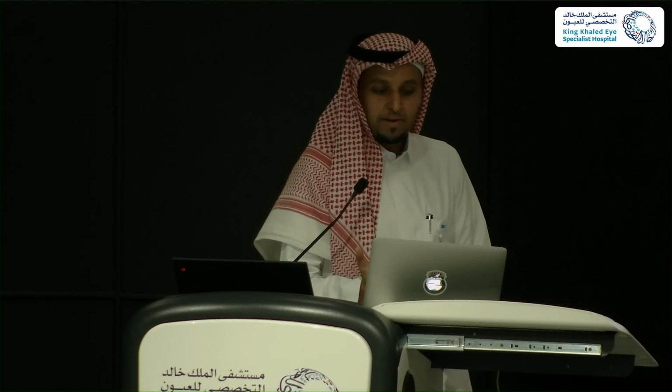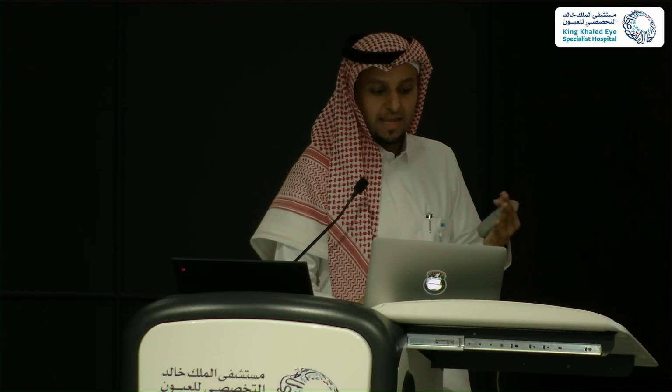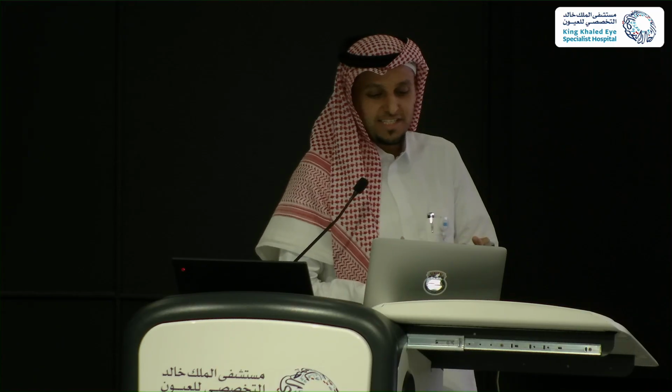So basically, the last procedure in anterior lamellar keratoplasty is DALK, and DALK, based on the Sarnicola classification, is broadly classified into predescemetic DALK and big bubble DALK. However, after Dua's layer was introduced, the classification is now a bit more confusing.